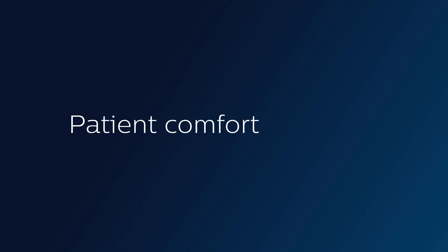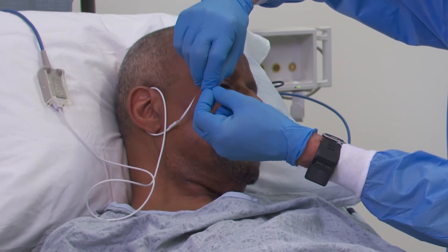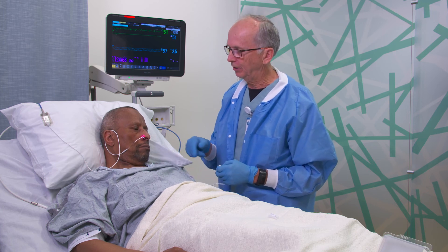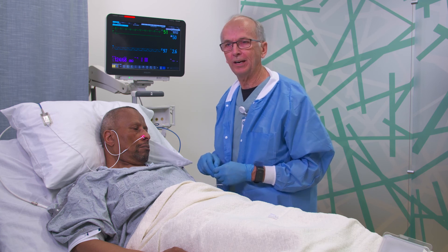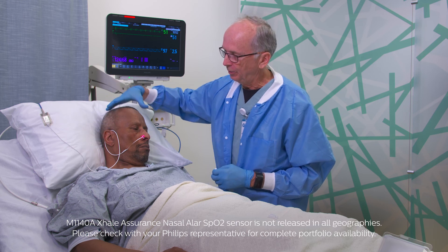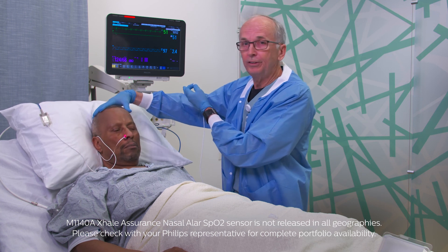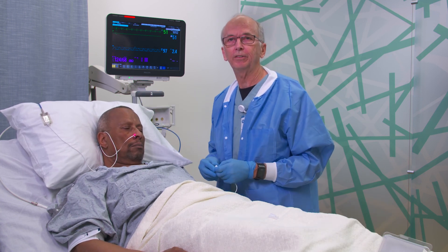There's actually a space in there so it's very minimal pressure and they're not uncomfortable to wear. People very quickly accommodate to the probe. They are aware of a reddish light at the corner of their eye, but because the cable is looped over the ear, when you move your head the sensor doesn't move and you don't see motion artifact like you would from a finger sensor.